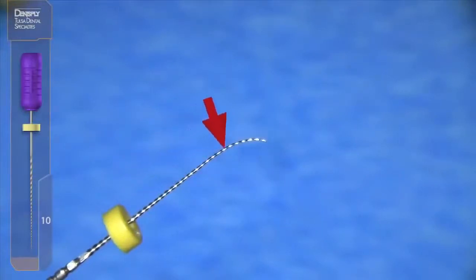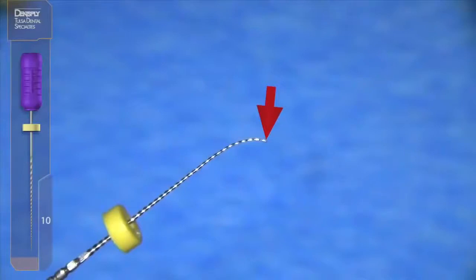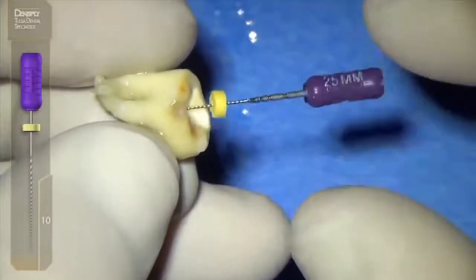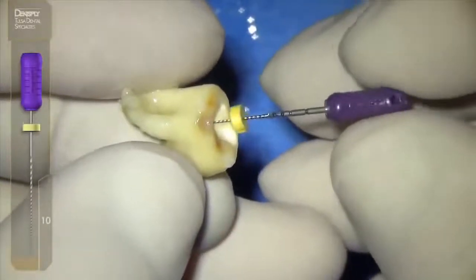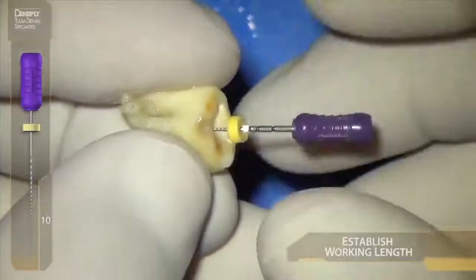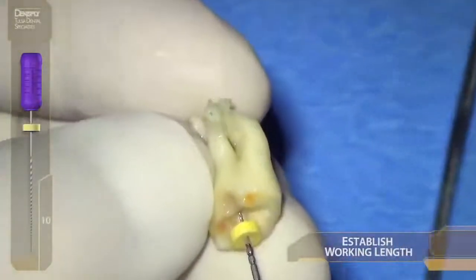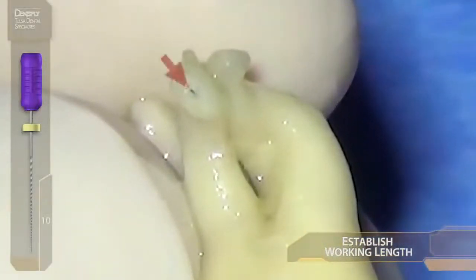This makes again a SMART file. By simply slipping and sliding into the now unfettered orifice, we can see that with restraint and without pushing, we are able to easily follow this double S curve to the radiographic terminus — which we know is slightly beyond the physiologic terminus, the exact position we want to be at to make a glide path, because we want to stay patent.